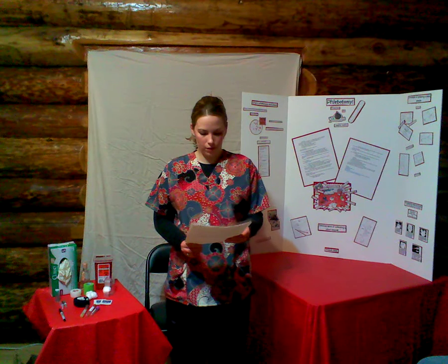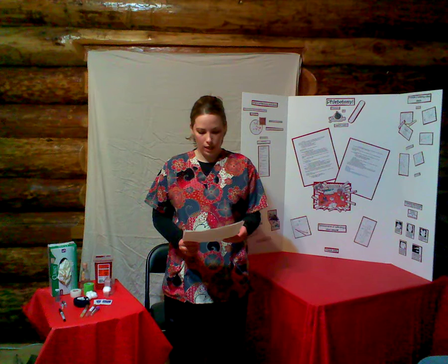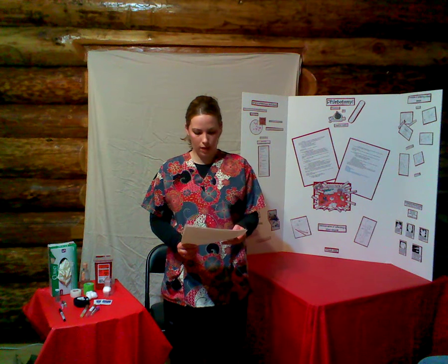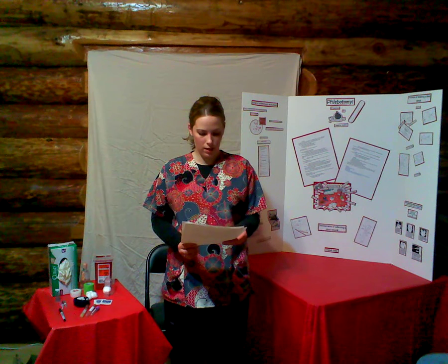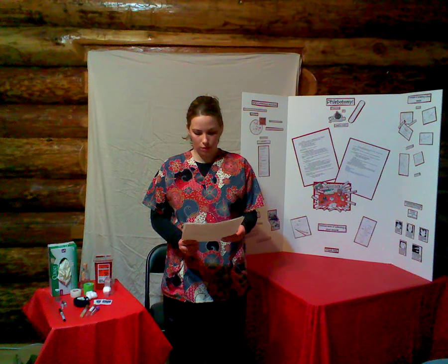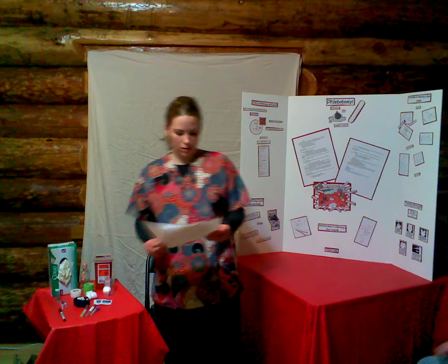My information was referenced in the 12th edition of An Introduction to Phlebotomy by editor Frederick L. Kilch, MD, PhD. Now that we understand the steps of the procedure, let me demonstrate collecting a blood sample.